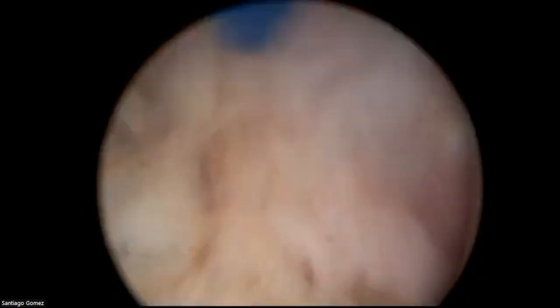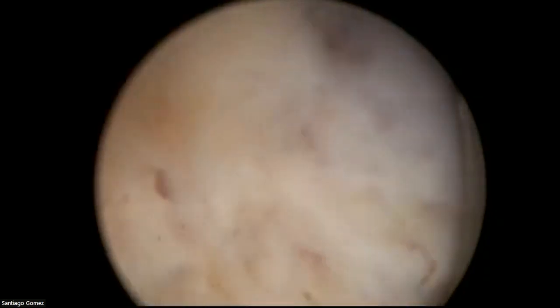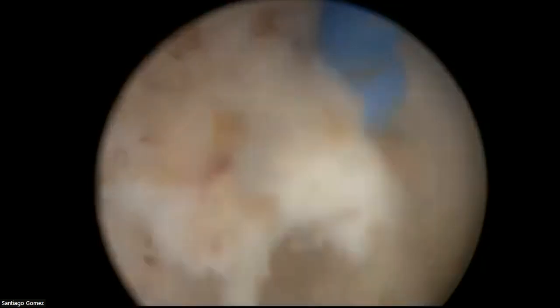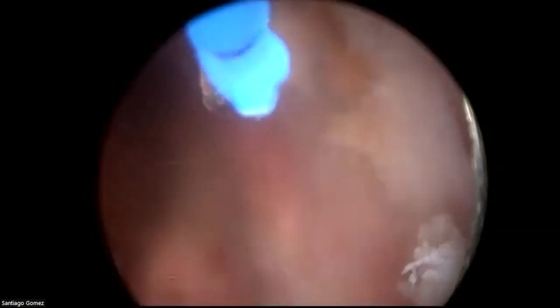This is a nodule that I left. You see, I tried to dissect it, but I couldn't. So now it's the trimming phase. I can go back, of course, and make sure that I can remove this little nodular aspect. It would perfectly show up if you do an ultrasound. This is quite nice. It will show up very nicely. Ah, there it is. Okay.